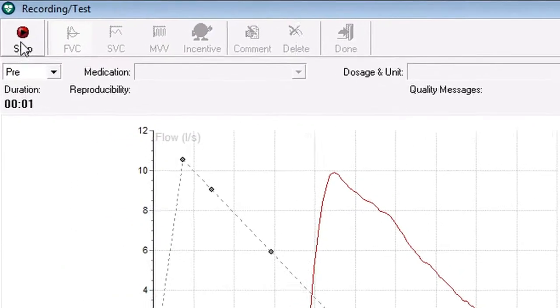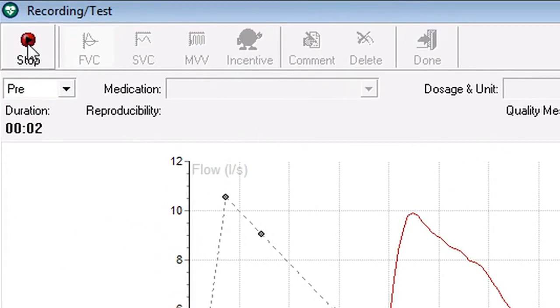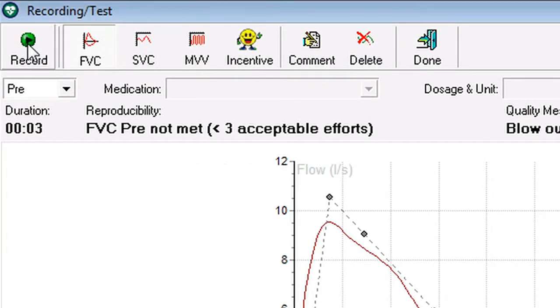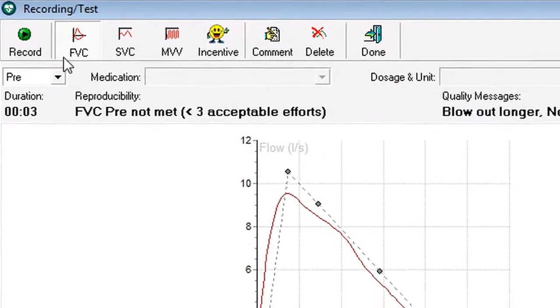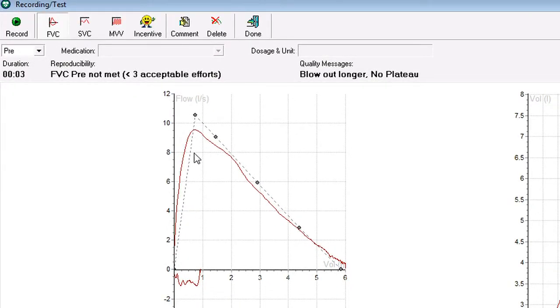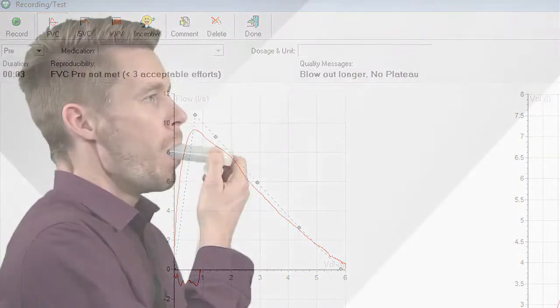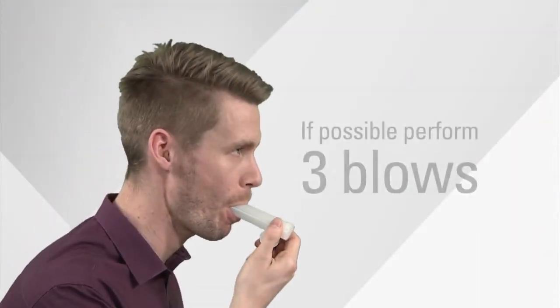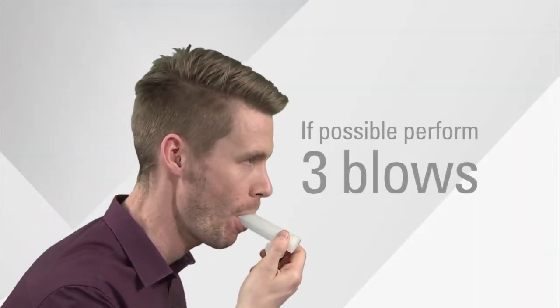When they finish the effort, click on stop and their blow is compared to the predicted norms. Again, you should aim to do three FVC blows.